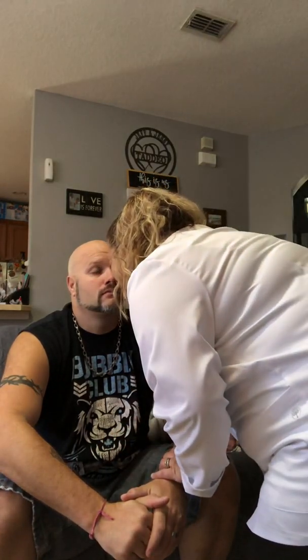I've checked visual acuity, extraocular movements, corneal reflexes, his pupils, and now the ophthalmoscope exam, where we dim the lights in the room. Now look inside. I'm looking to see if I can see the fundus and the optic disc. And then I'm going to examine the other side.